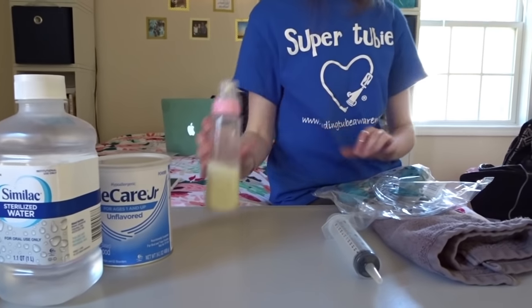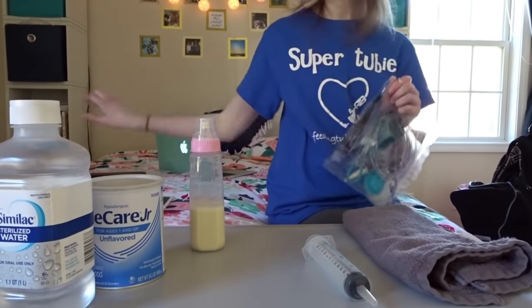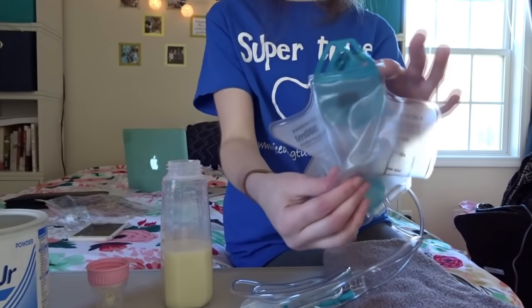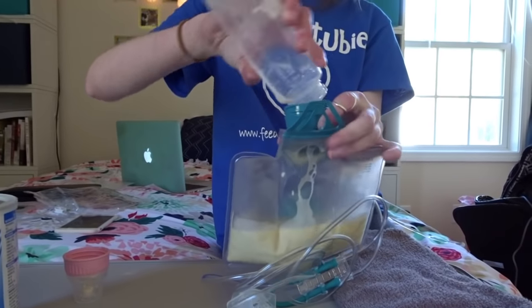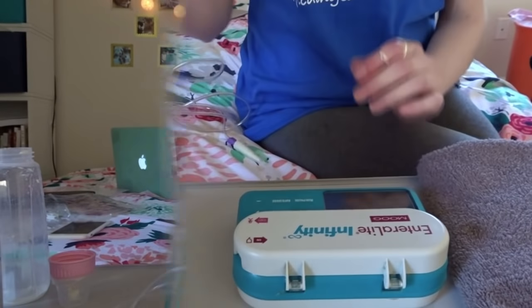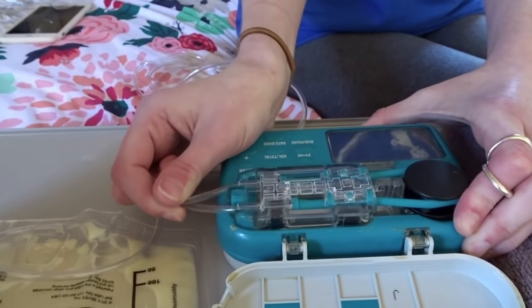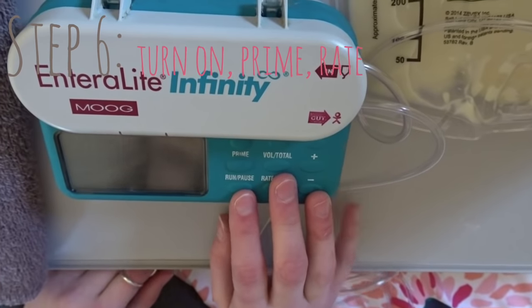I added 5 scoops, and step 4 is to pour it into this bag. Step 5 is to connect this bag to your set, and it will lock in there. Step 6 is to turn on your pump, prime, and set your rate.